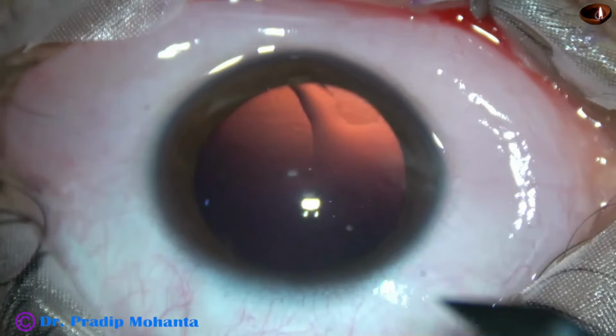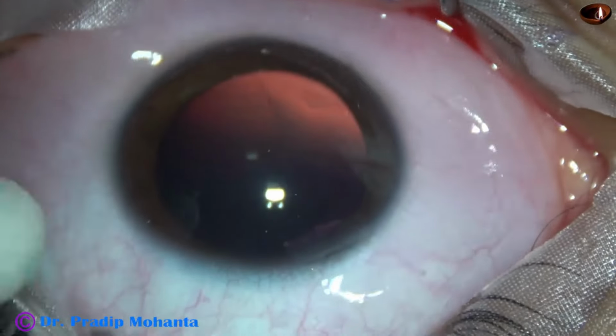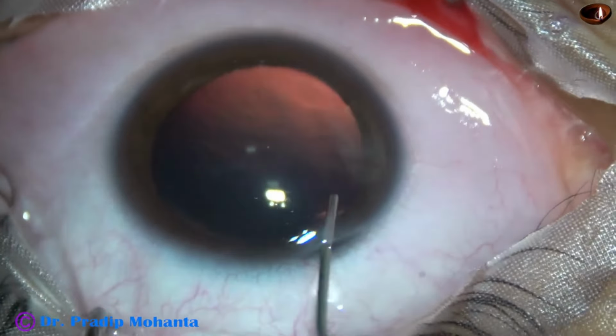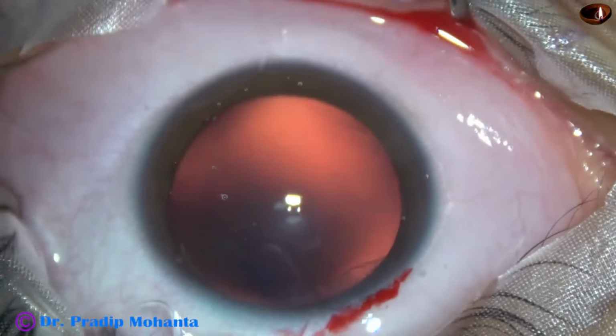Implantation. The patient is a young lady of 20. She has been explained all the pros and cons of clear lens extraction with intraocular lens implantation. The option of phakic IOL was given. Contact lens she doesn't want to continue anymore. Lasik is contraindicated in this case. So, after explaining all the pros and cons of phakic IOL and clear lens extraction, the patient opted for clear lens extraction and intraocular lens implantation.